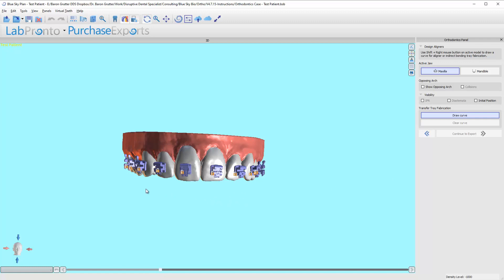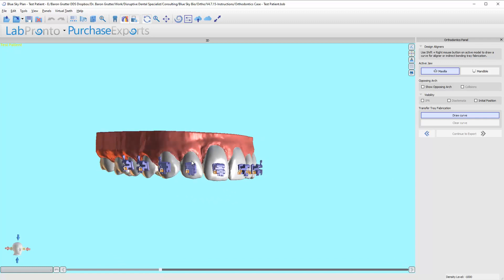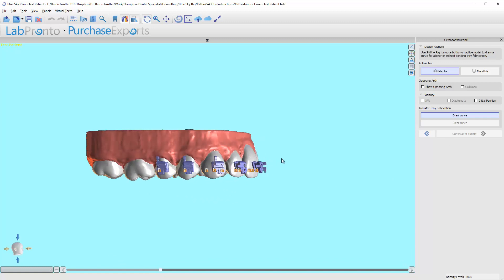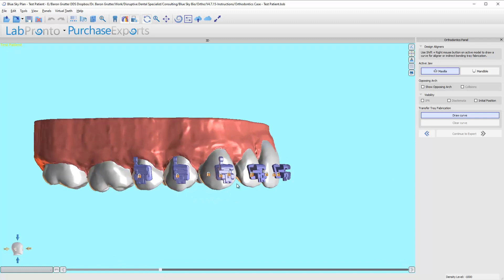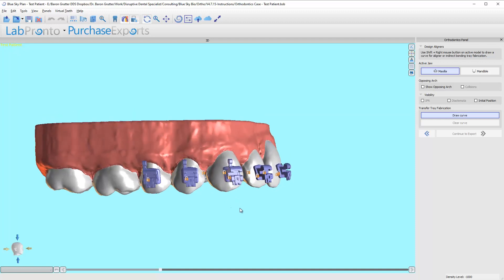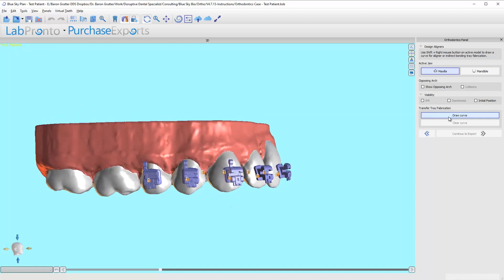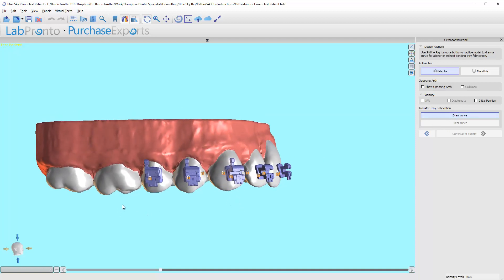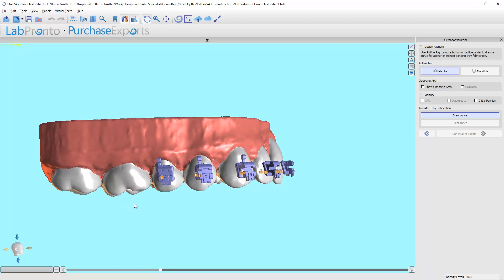If you use the surgical guide software, this is going to be pretty easy. It's already highlighted to draw the curve. We're going to hold the shift button on our keyboard.